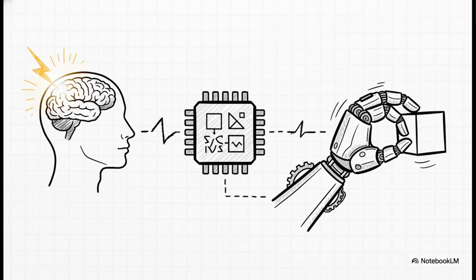This is where all the pieces come together. EMG translates human intent into robotic action. Think back to our first question about how flex controls a robot. For an amputee using a prosthetic arm, the biology and the math totally merge. The user thinks about flexing their missing hand, the remaining muscles contract, and the electrodes pick up that invisible spark. The software calculates those peak amplitude and RMS values we just talked about, and those hard numbers act as digital commands. They tell the robotic hand exactly when to close and exactly how hard to grip. It's just a brilliant fusion of human biology and computer code.